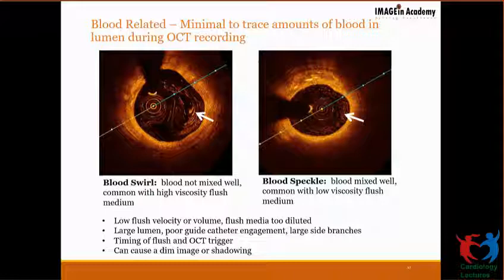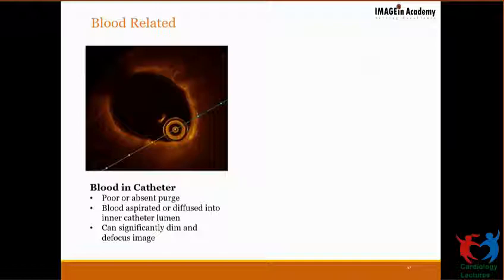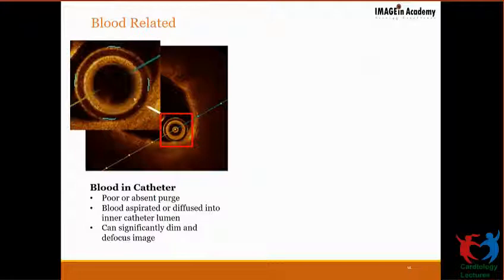Well, there are some other blood related things. If the blood has seeped into the catheter, the image will become absolutely dim. That means you've not purged, and you can also see some rotating defects. This shows the image with the inner lumen completely filled with blood. So you need to purge this before you acquire the image. Otherwise, you'll get a very dim image. And if there is partial filling, then you'll see a filling defect rotating in your axial images.